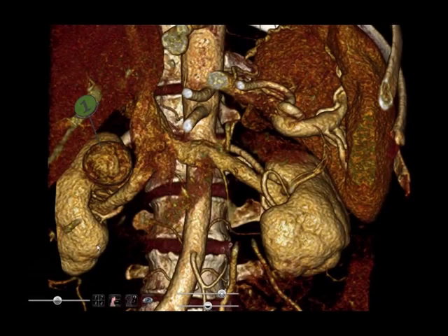So we started looking at 3D volumetric reconstructions of the organs straight from the CT data. But you can see the computer and the image has no idea of what a structure is. It just knows that it's of a certain density, so it goes, well, I'll color everything the right way. So it's a bit of a jumble to pick out, and there's no way to pull these things apart to get a better look at it. You just end up with a blob that you can kind of rotate round and not do much more with.